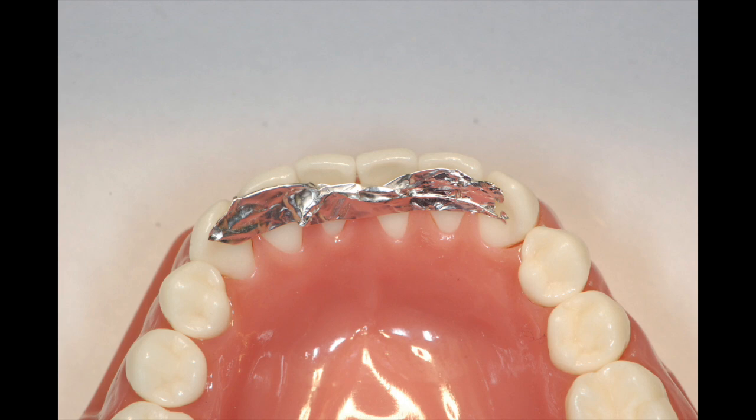I've found that the easiest way to size up and measure the amount of material you need to reinforce the lingual is to take a small piece of tin foil and adapt it to the lingual surface of the anterior teeth.